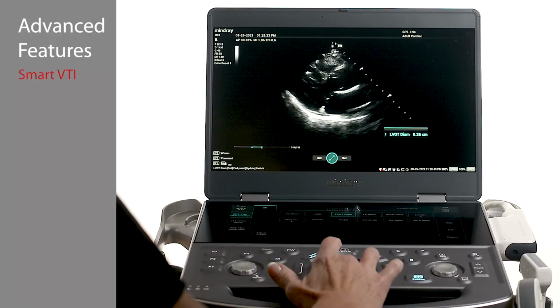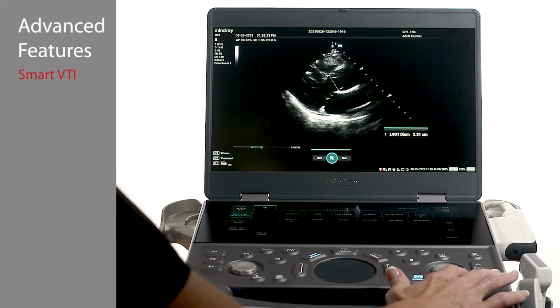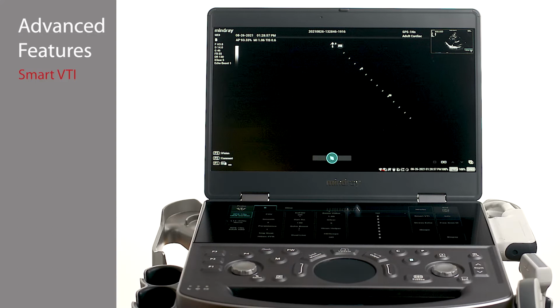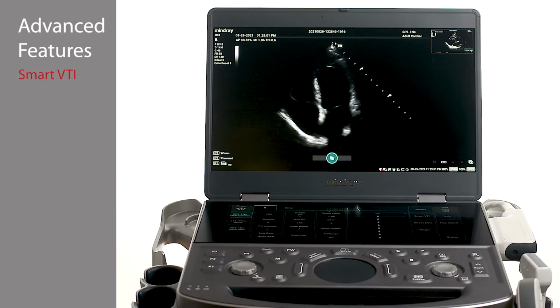To measure, obtain a parasternal long axis view and press Freeze. Scroll to End Systole, tap Measure, then choose LVOT diameter, and place the calipers to measure the outflow tract. Take care to tap the last caliper so that the measurement turns white. This assures the value is saved for the upcoming calculation.